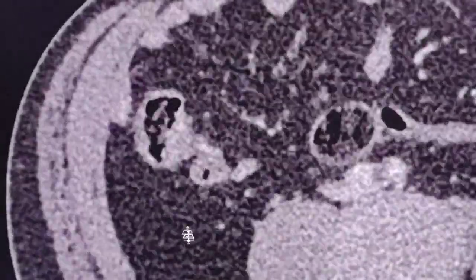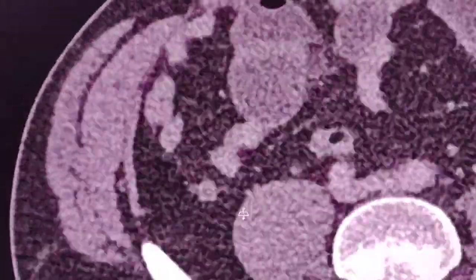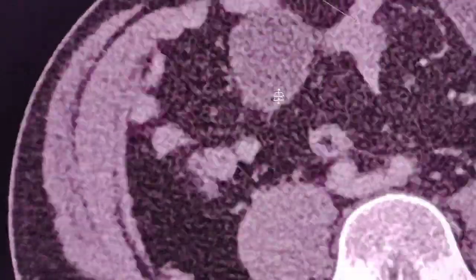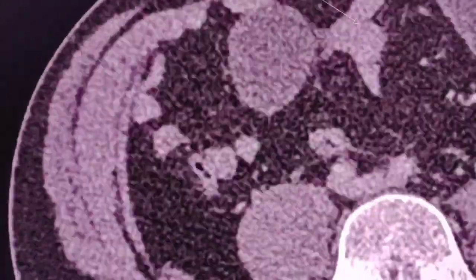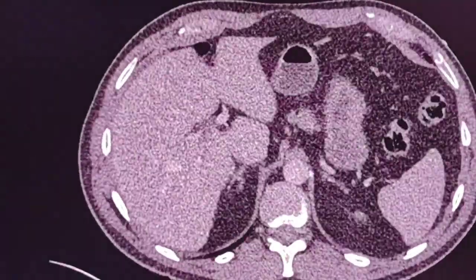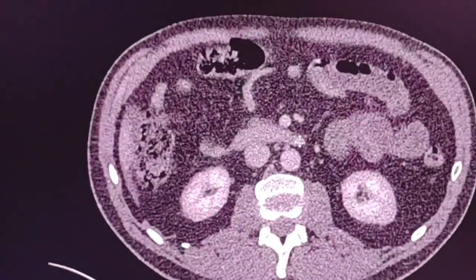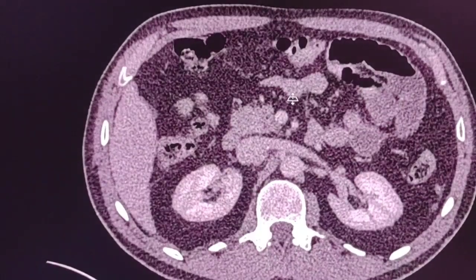The terminal ileum is not dilated. Here are the loops of the terminal ileum. However, we can see dilatation of the distal part of the ileum with some air-fluid levels here and there. The stomach shows no dilatation, and the duodenum and jejunum show normal caliber with no dilatation, probably due to excessive vomiting.